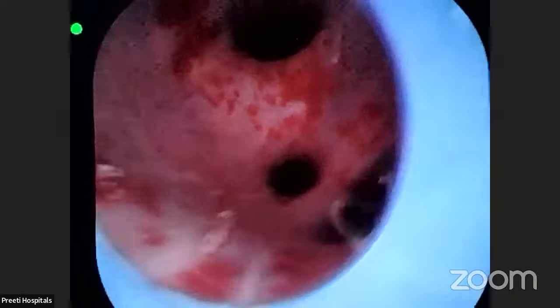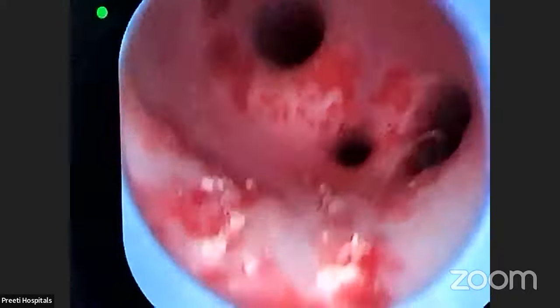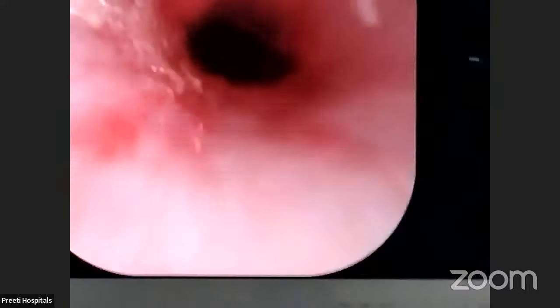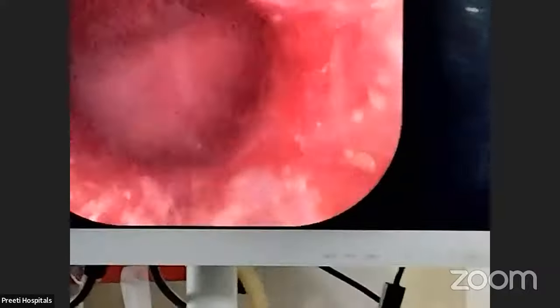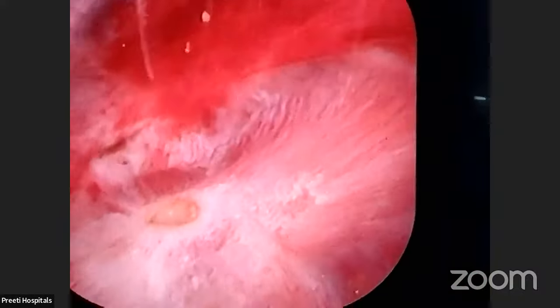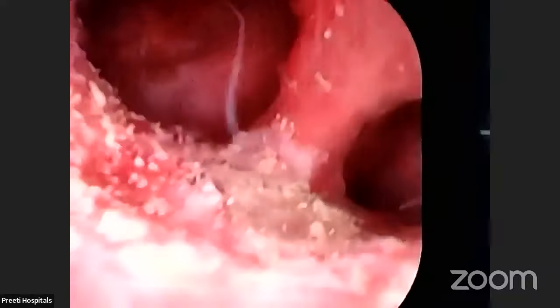What happens? Now we were a little scared. Now see the PUJ. Any problem? No. Any small fragments, see, this powder also we can suck out. The entire kidney is cleaned. Like I say, this is like mopping, whereas what we do in RIRS is sweeping. Sweeping and mopping, there will be a difference. Dust will be there inside.